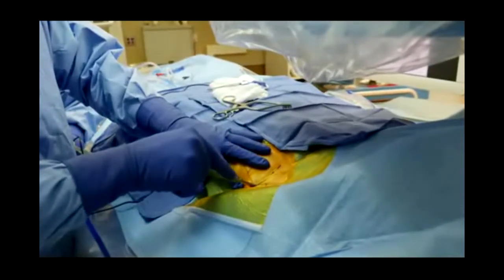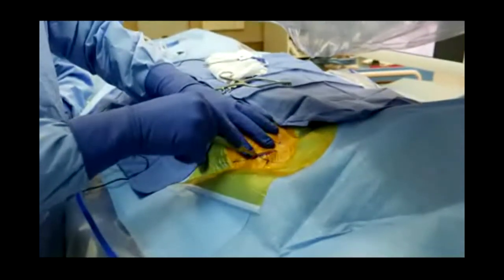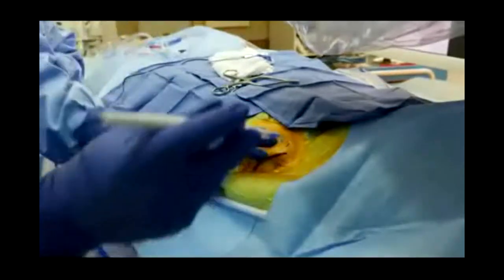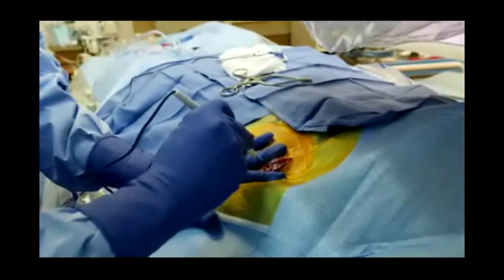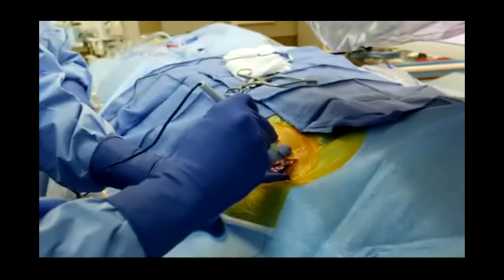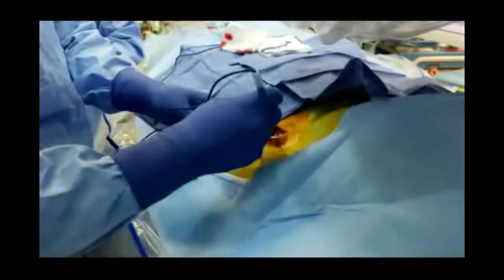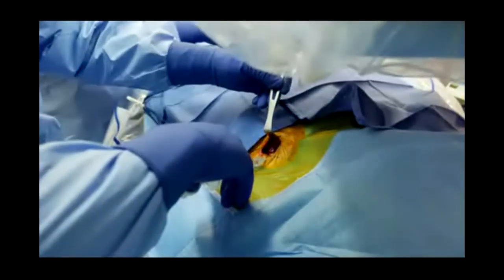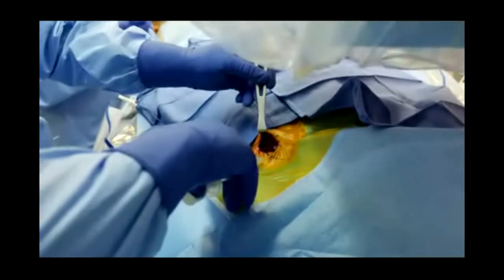We break through the skin layer into the subcutaneous tissues, and then with cautery, we'll extend that incision down to the pectoral fascia right over top of the muscle, being very careful not to break the fascial plane. Then having done that, we'll need to numb the skin inferiorly below that incision site to make the actual cradle for the device pocket.